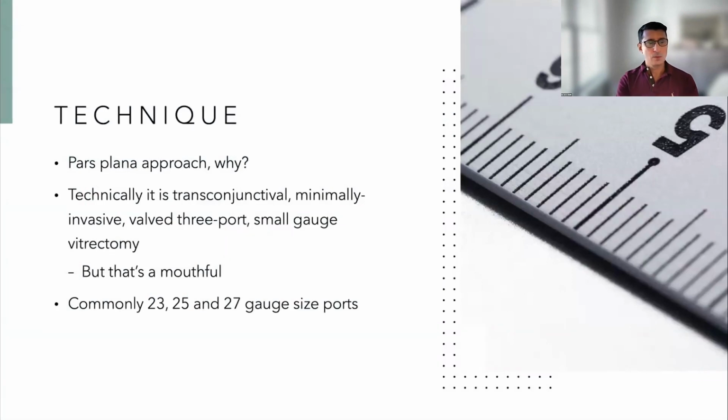So what is the technique to do a vitrectomy? Typically we go pars plana approach. Most retina surgeons are doing a pars plana approach, and the reason why is because that is an entry point into the eye where, God willing, we're not going to hit vital structures.